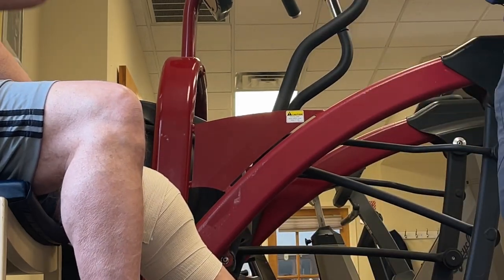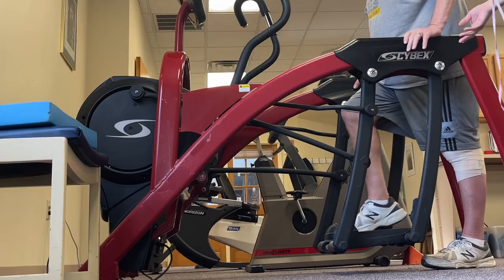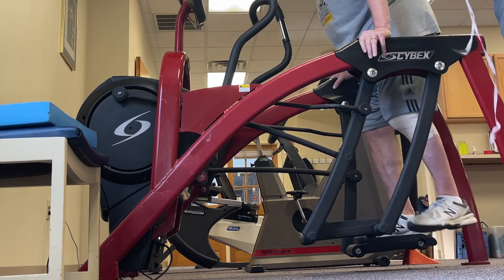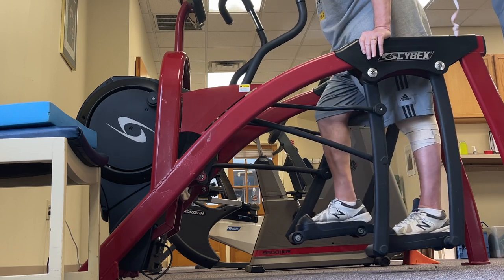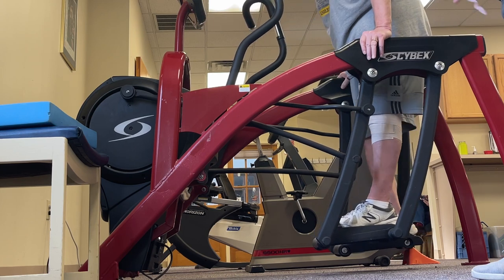Have you done this machine today? Let's jump on here and do this a little bit. The reason I like this machine right now is the bike bends the knee too much and then the wrap will just fall apart. This will let you get the knee moving but without a lot of knee flexion.